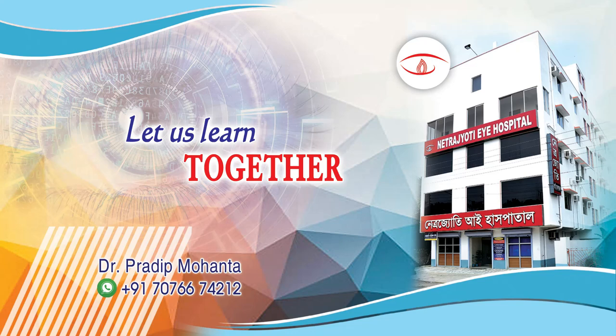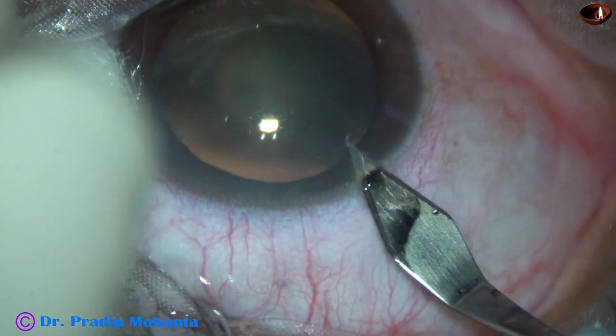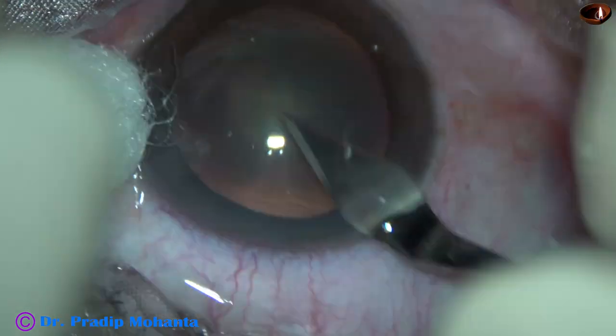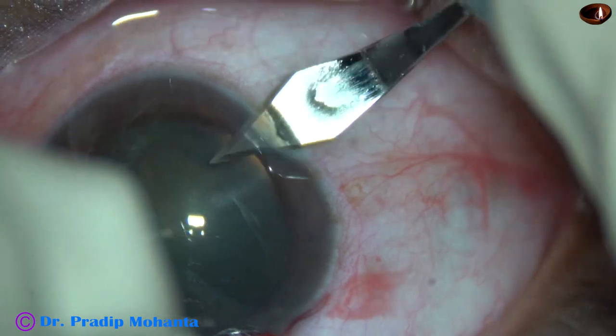Friends, welcome to my workplace at Ranagahat, West Bengal, India. In this video, we are going to watch the carousel technique of nucleus management for a soft cataract. Let us observe this surgery.